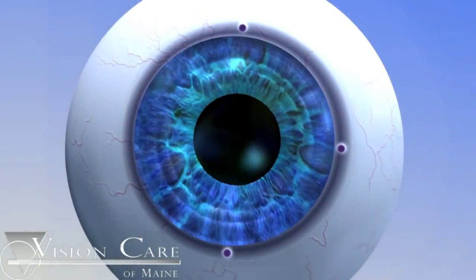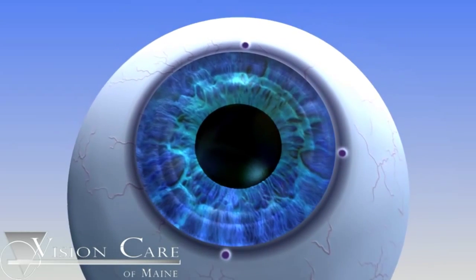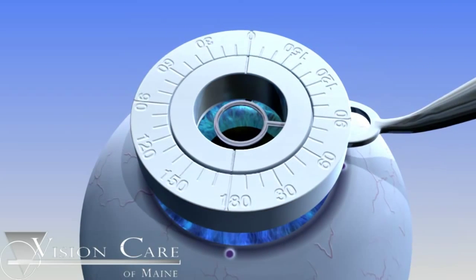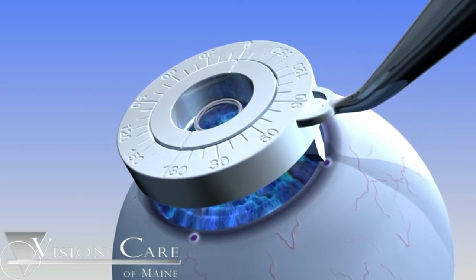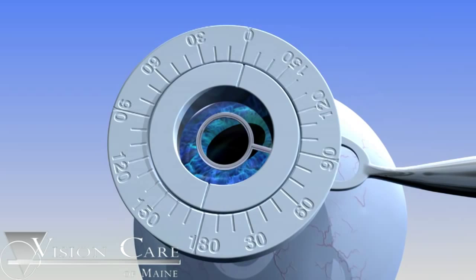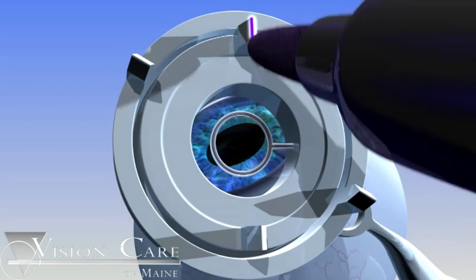The surgeon will use these reference marks later in surgery to mark the steep axis. Once the reference marks are placed on the cornea, the surgeon uses the marks to align the axis marker. The axis marker enables the surgeon to place linear ink marks on the cornea, which identify the precise axis of the astigmatism. Using the information derived from keratometry readings and corneal topography, the surgeon rotates the dial on the axis marker to the appropriate degree where the steep axis of astigmatism was identified.